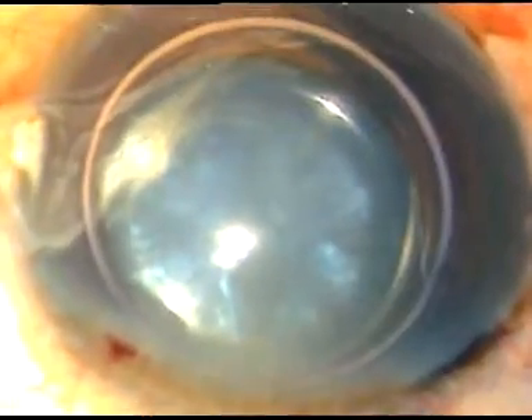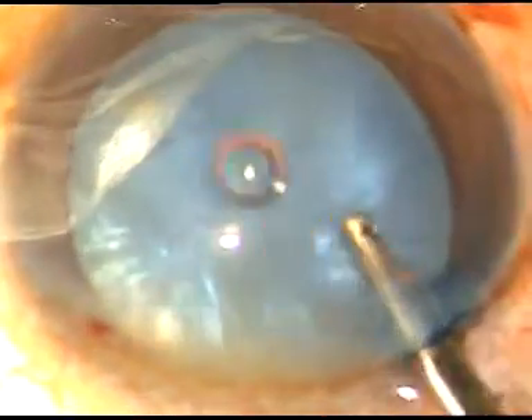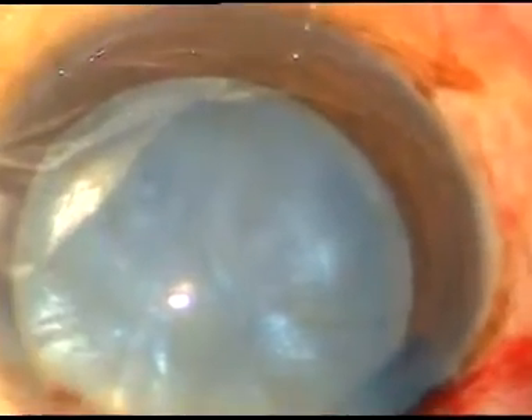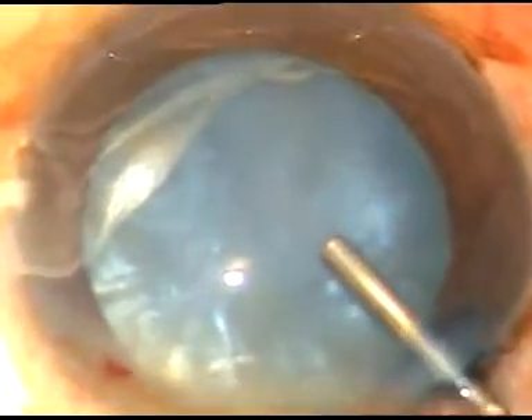A little bit of adrenaline. Now the dye is washed out. Now I use only HPMC — that is hydroxypropyl methyl cellulose — in intumescent cataracts. This is hydroxypropyl methyl cellulose.